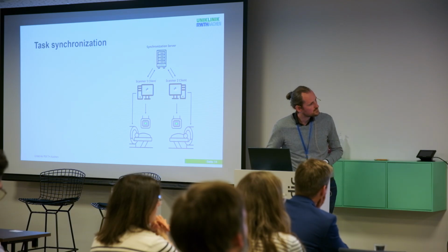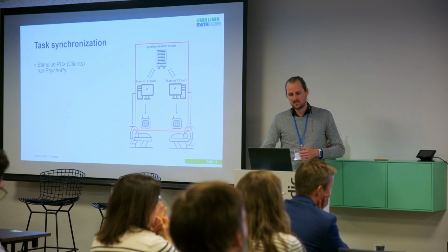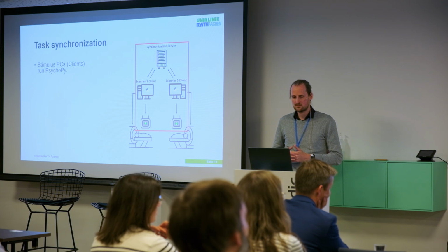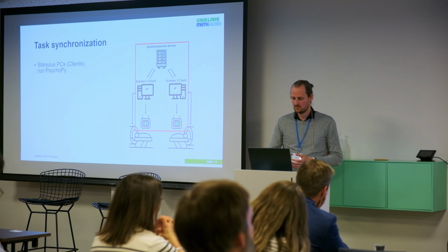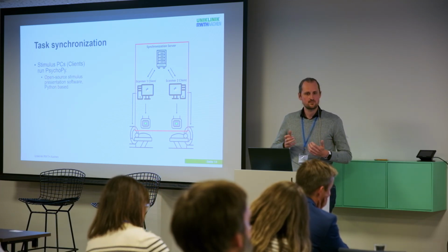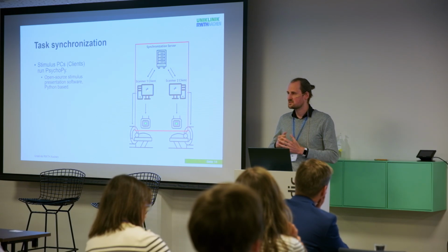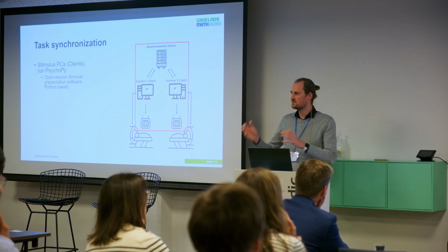So this concerns this part of the setup. What we did is we take our stimulus PCs, which we have located at every MRI scanner, and on these we run PsychoPy. These PCs, we generally refer to them as the clients. PsychoPy is this open source stimulus presentation software. The best advantage of this, aside from being free, is that it is Python based. And when something is Python based, it means it's very easy to either modify the scripts themselves or to program something which interacts with this task.